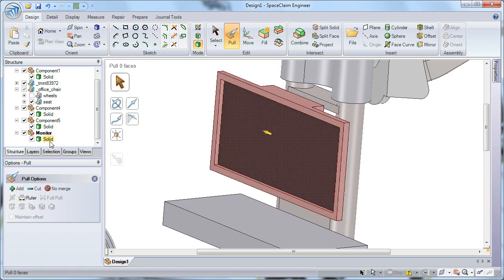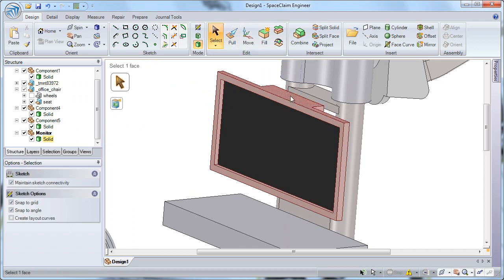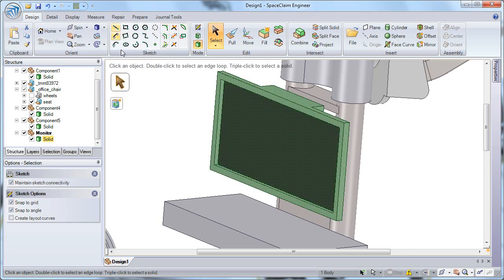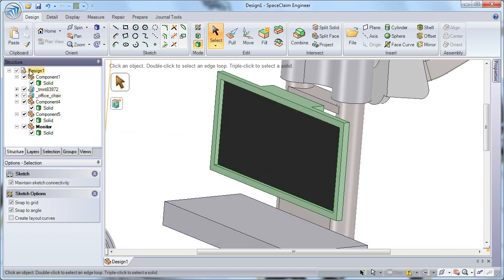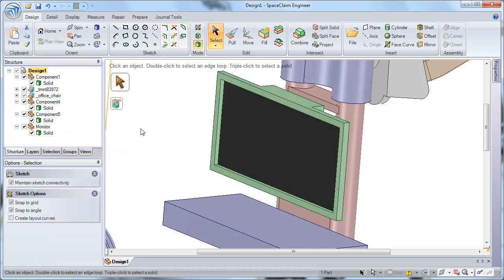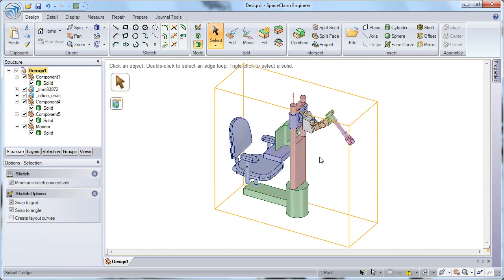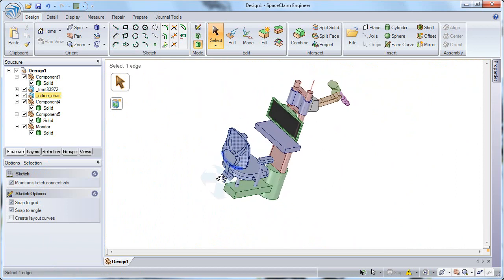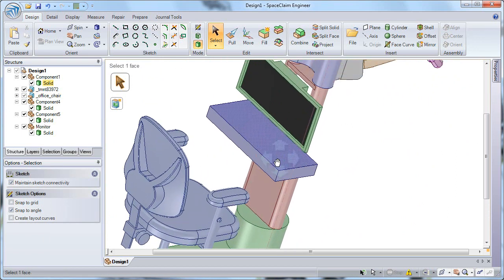If I want to override the color of that display, I can triple click on any face of my solid. It'll select the entire solid. I can go to my Color tool to remove the color override, making that monitor green, which is the default color. So I'll then reactivate the top level design, and you can see the medical cart that we're starting to create here. So next thing I'd like to do is edit this table, the blue table.